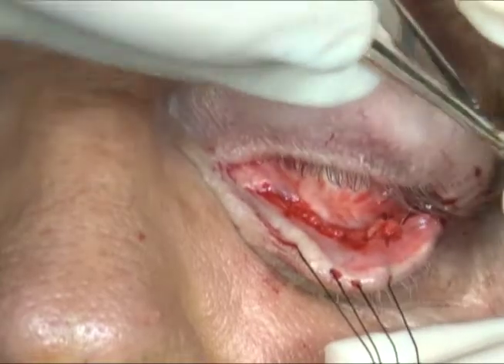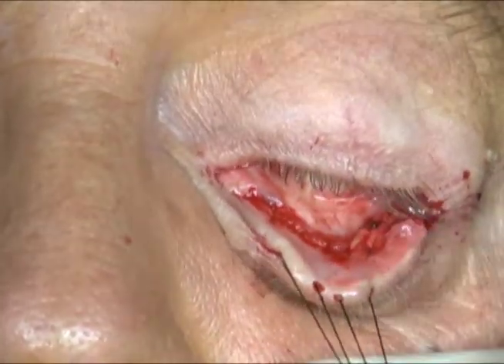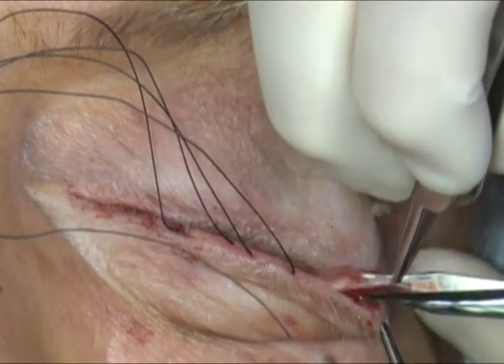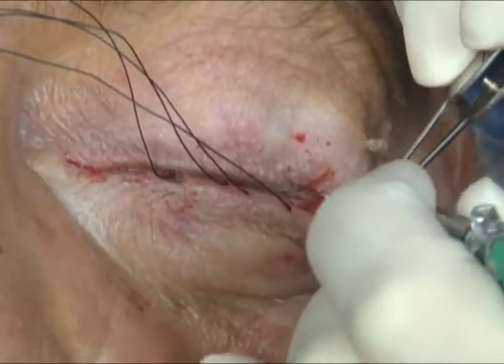The lower lid will then be tightened horizontally with a standard lateral tarsal strip. Westcott scissors are then used to dissect between the anterior and posterior lamella for approximately 5 millimeters. The mucocutaneous junction of the posterior lamella is then excised.